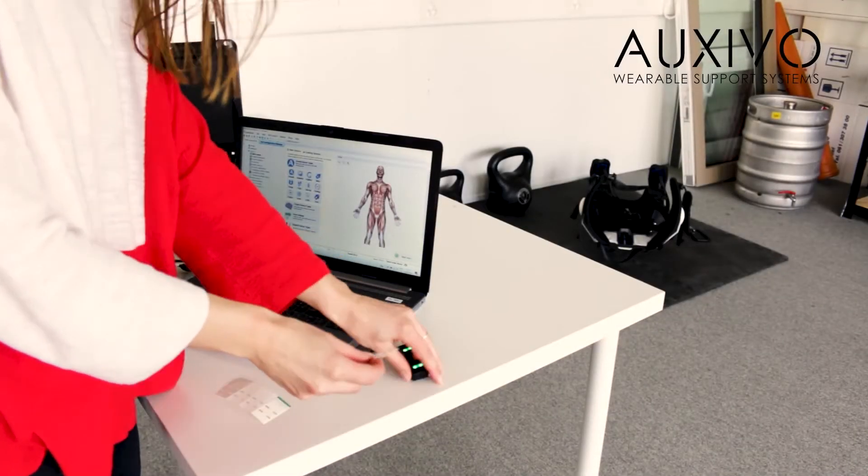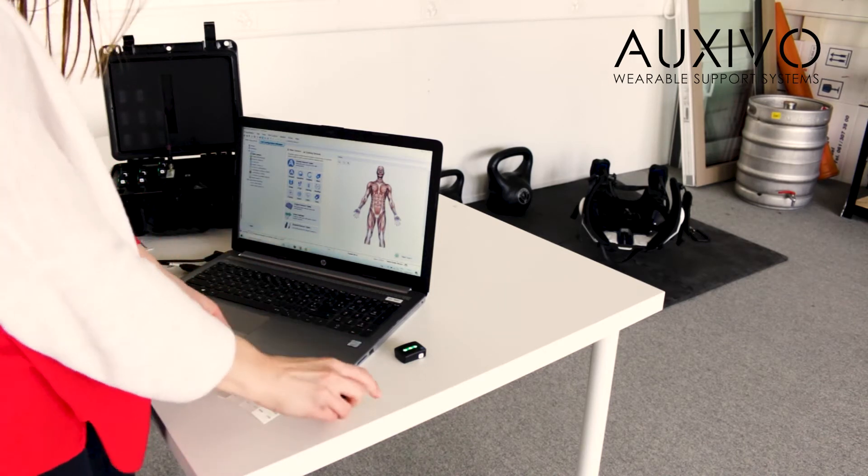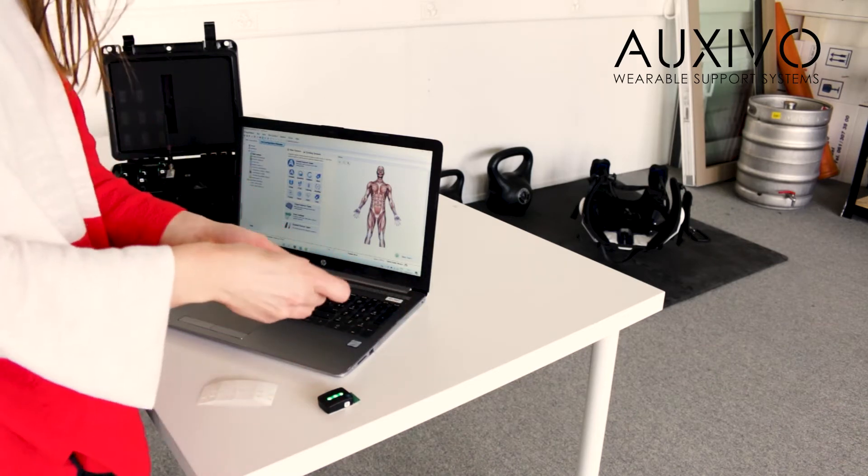Before our participant arrives we prepare the carry suit and the measurement equipment. In this experiment we measure muscle activity with a method called surface electromyography, or short EMG.